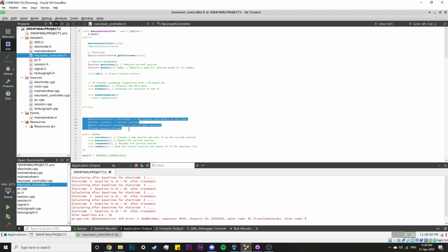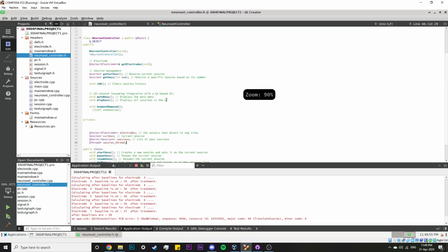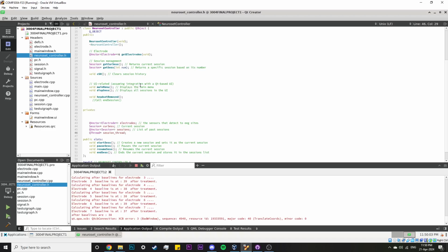The main thing that we want to cover is that as the sessions are running, they're constantly storing the signal information and the baseline frequency until it is either paused or ended. Once a current session is ended, we store that session's information in our list of past sessions, which you can get from here, and display all the same information it had while running, including the ended baseline frequency. This is due to the centralized design of our code, where Neuroset Controller has everything connected to it and stores all the session history. Every time we make a new session, we append that session to our list of sessions. So we simply use the getter of session history from our Neuroset controller function, and then we're able to see and display everything that we need to.